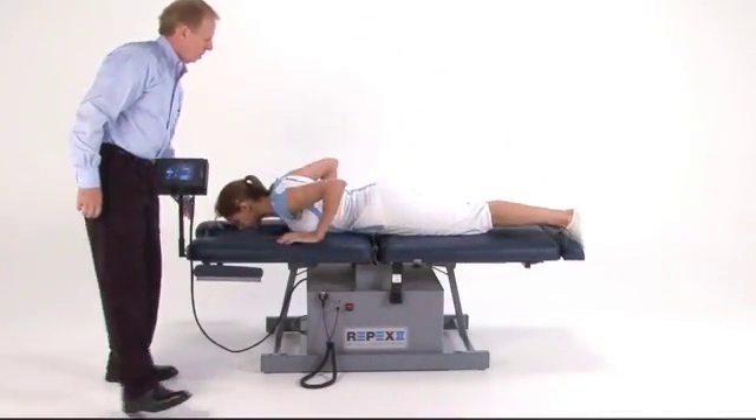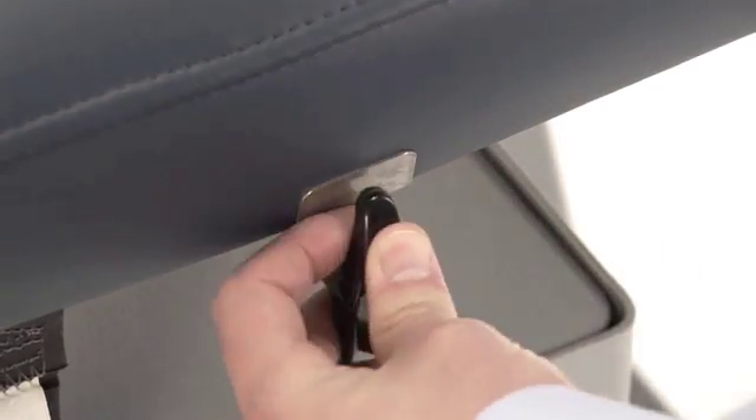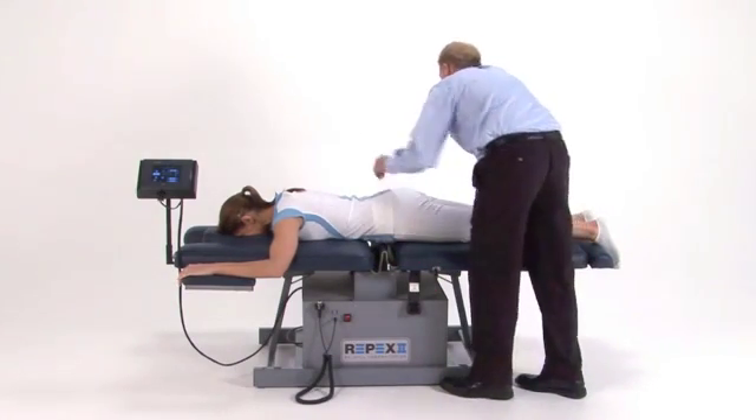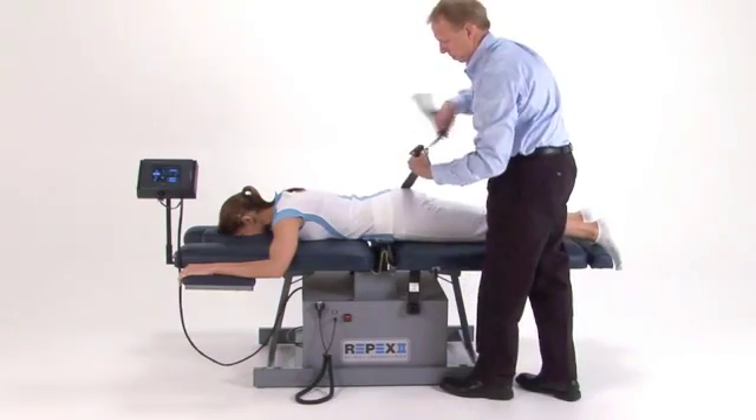Have the patient lay prone on the table with their face comfortably inside the face cut-out section. Disengage the cushion lock pin to allow the bottom section of the table to adjust back and forth freely during treatment. Then secure the belt over the sacrum and tighten.